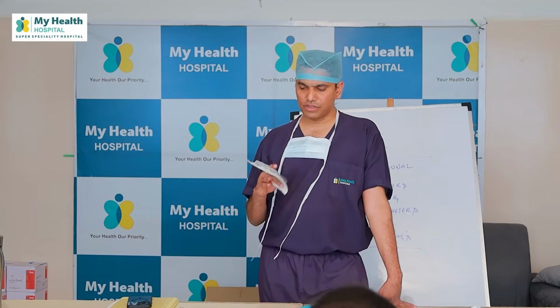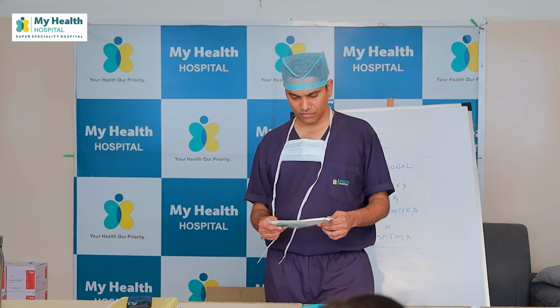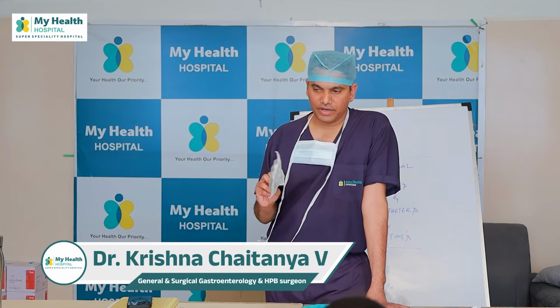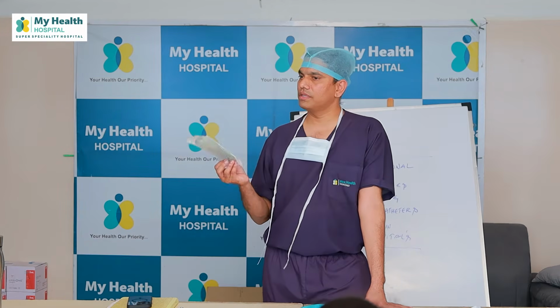What is the other material? What is this material made of? This is not silicone. No, this is PVC. And the other material that we use is silicone. Silicone, what is the advantage of using a silicone?